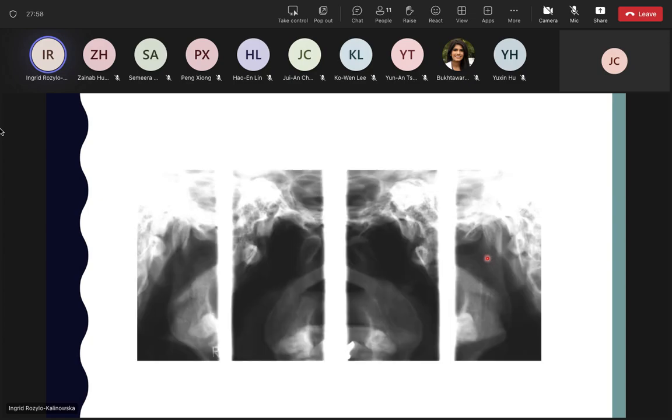And this is also one of the cases of mouth fully closed and fully open. And you can see that in this patient, the mouth opening is very important, because the condyle traverses to the front anteriorly in relation to articular eminence.